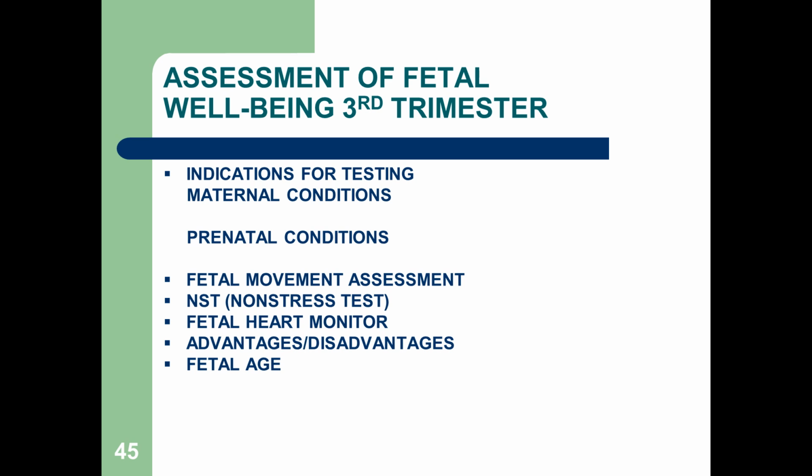So if you ever have a patient that says, I'm not feeling my baby move, have them monitored. Maybe the baby's asleep, have you eaten today? Kind of stimulate and see if you can get the baby to move, okay? Non-stress tests, fetal heart monitor, we'll hook them up and see if the baby's looking good on the monitor. And we have to keep in mind fetal age.